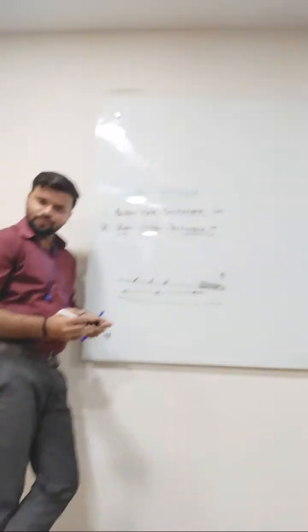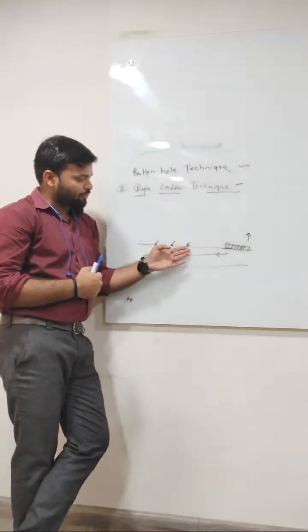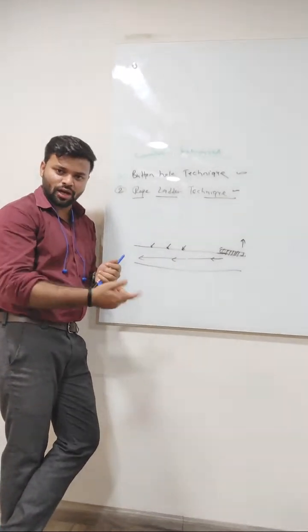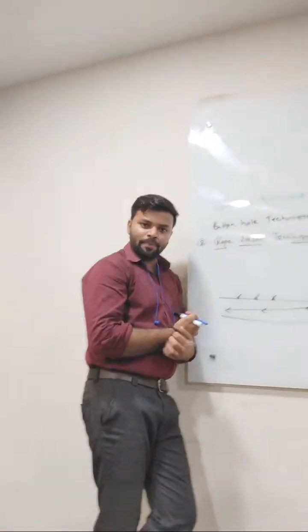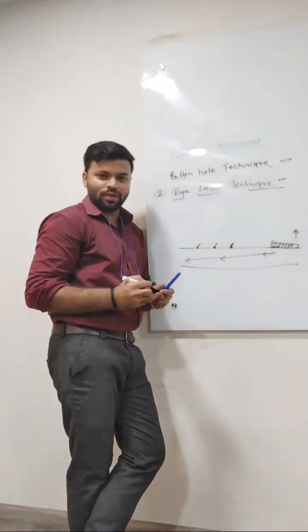So, Sanjay, in this technique every time we are changing the site of the patient. Exactly. Every time we have to change the patient's prick point basically. When you cannulate the fistula, you have to change the point every time. Due to the change of the point, the point will get enough time to heal. To heal back, and again be ready for the cannulation. So these were basically the types of cannulation techniques you can use for patient fistula cannulation.